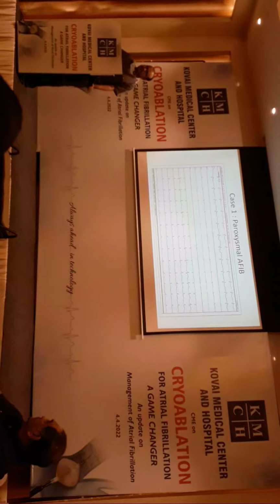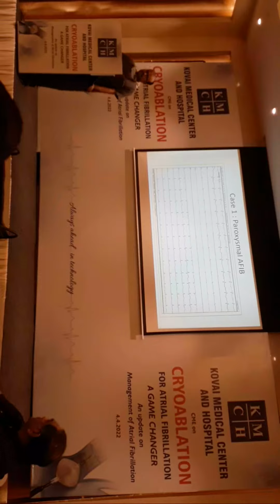I stepped up the flecainide dose along with beta blockers, and he was doing well. In the last 3 to 4 months, symptomatic episodes increased. He was complaining of more and more palpitations, and he had one documented episode some 2 months back. So we decided that we'll offer him cryoablation, and the patient was also willing for that. So we took the patient for cryoablation. The patient has a structurally normal heart, with mild coronary artery disease. LV was perfectly normal. LA was around 38 millimeter, so there is no dilated LA here, a normal sized LA.